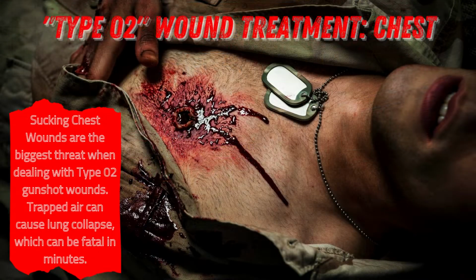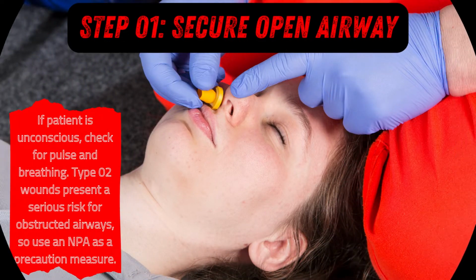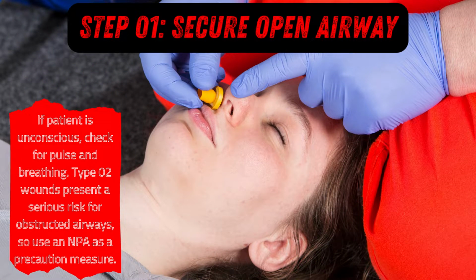Our next injury category are chest wounds. Sucking chest wounds and collapsing lungs are the biggest threats to life in these case scenarios. The nasopharyngeal airway, vented chest seal, and chest decompression needles are going to be your primary tools to treat this injury type. Step 1 is to secure an open airway. Your patient is likely to be unconscious or at least struggling to breathe. This is where your nose hose will come in.